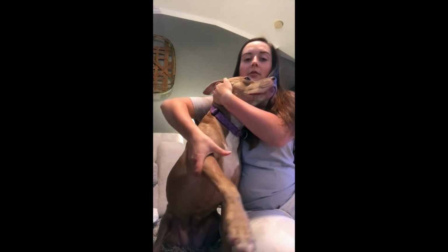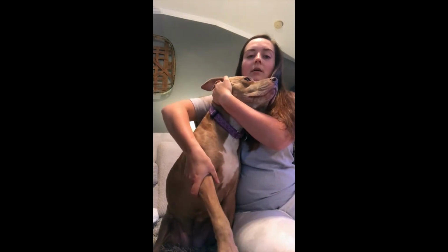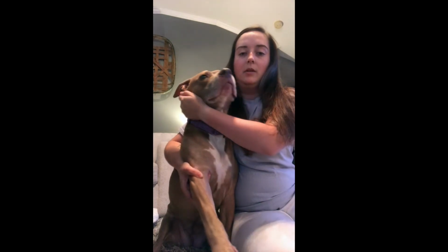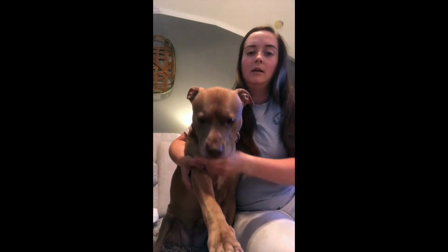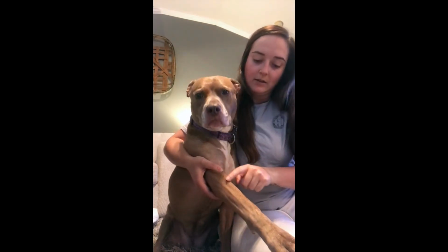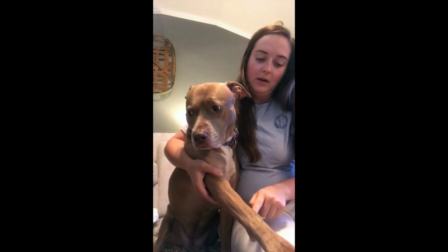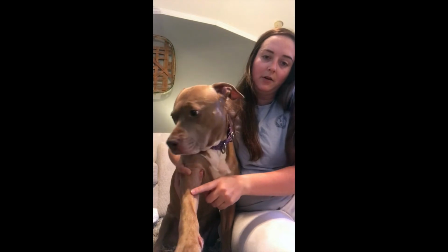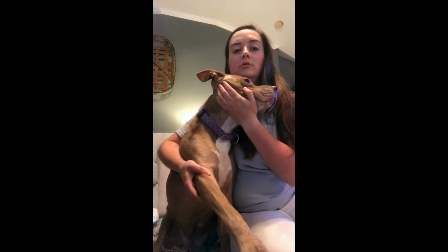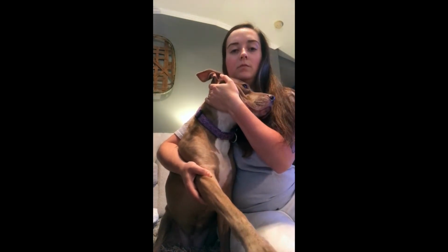Then with your thumb, you can grab the inside bend of her elbow and then roll out. And then you can see, once you occlude the vein, you can actually see the vein following the inside of her carpus all the way up to her elbow here. And then the technician would be able to draw the blood once you have control.